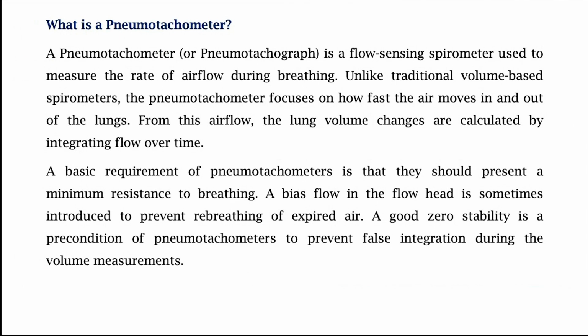Essentially, what is the principle? The principle is that there is a drop in pressure across a resistance, and this drop in pressure is proportional to flow. That is, the change in pressure is essentially the product of the resistance offered times the flow itself. And I just have to integrate this flow over time to compute the volume.